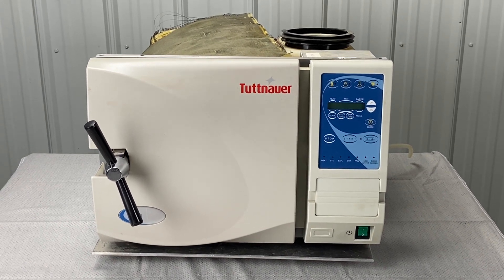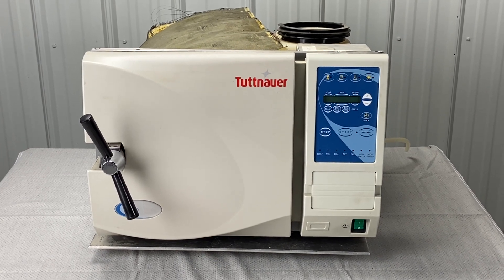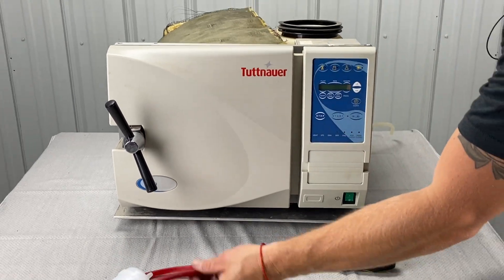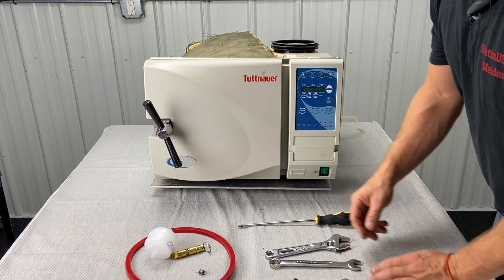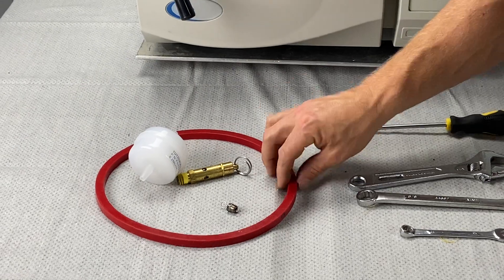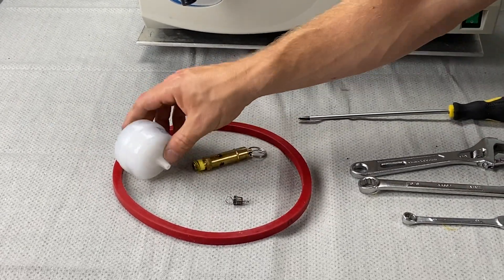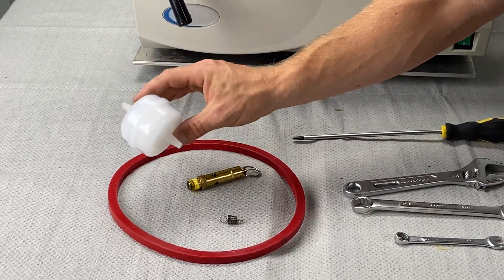The size of the chamber may be different, which would dictate a different door gasket, but annual preventative maintenance is always going to include a door gasket. For the EZ models, the annual PM kit includes a door gasket, an air jet, a safety valve, and a HEPA filter. The HEPA filter should actually be replaced every six months, and we'll show you how to do that in this video.